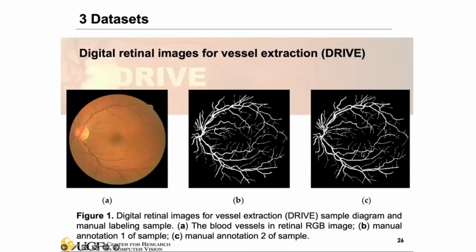And this is the DRIVE, digital retinal images for vessel extraction. So basically, you can consider this a binary segmentation, right? Just for the vessel extraction from the retinal image. So yeah, the white basically corresponds to the vessels. Then the black is considered the background. Okay.